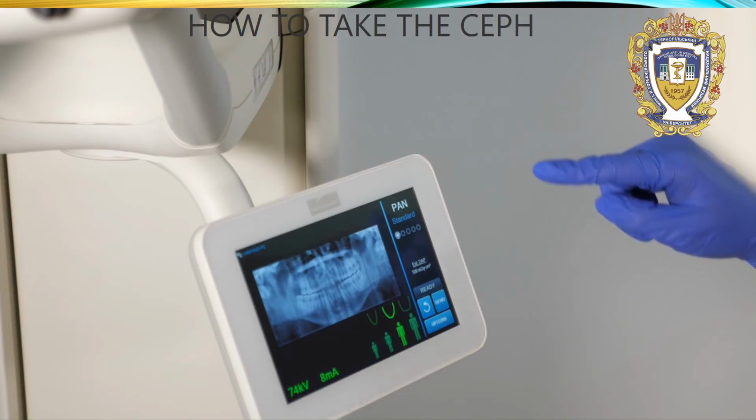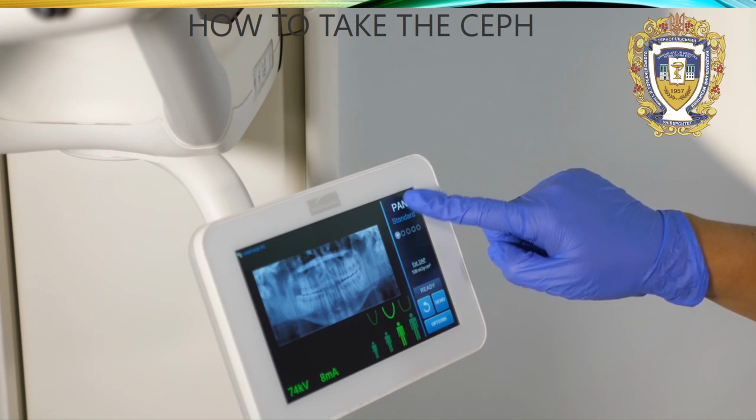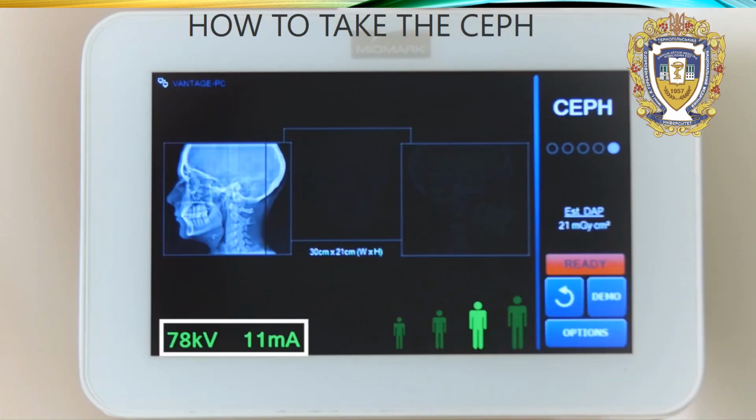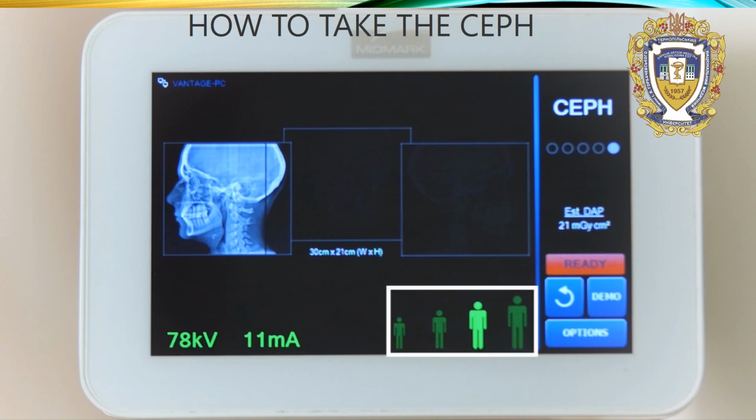First, tap the projection button on the top right of the Vantage Touch control screen to select the Ceph function. Second, explain the exam to the patient. Third, properly position the patient. Verify the technique factors according to patient size and anatomy. And last, acquire the image.